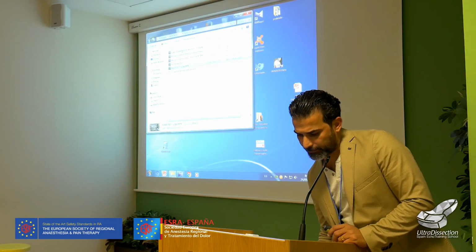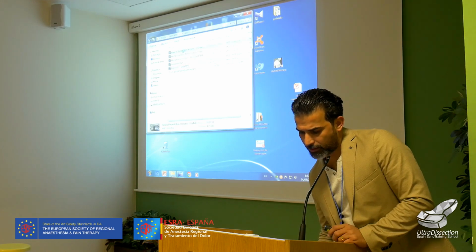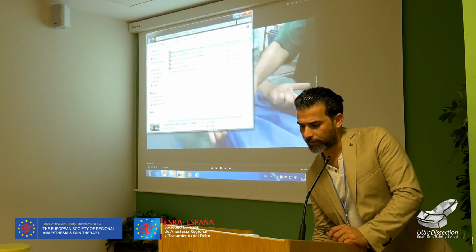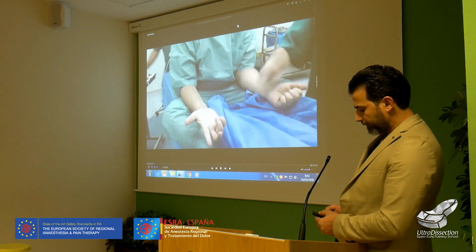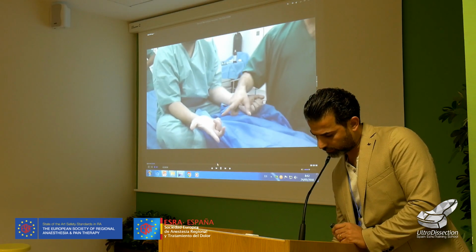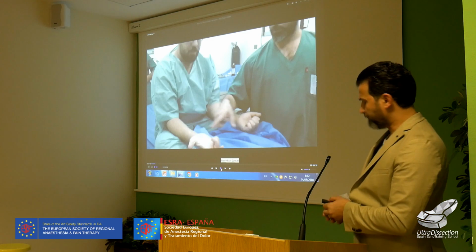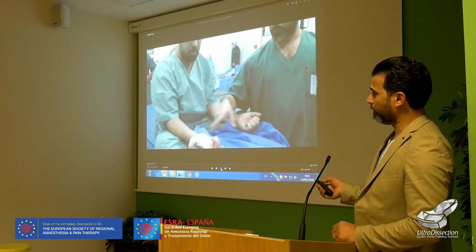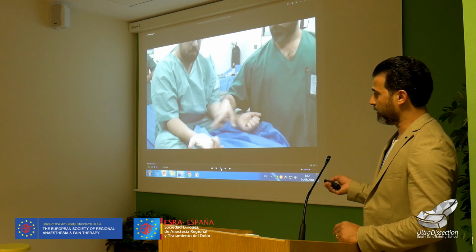So here, this is my topic today. This patient had median nerve injury after surgery for nerve decompression that failed after 1 year.